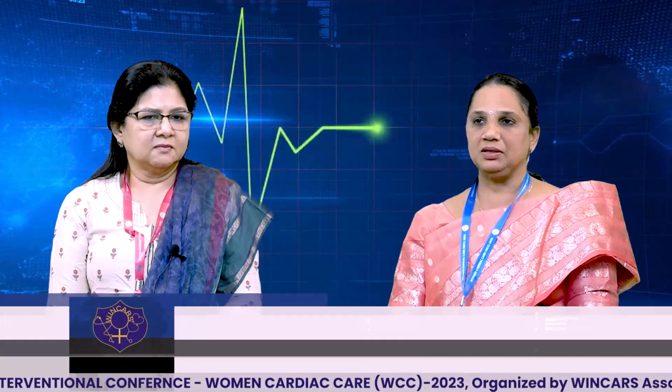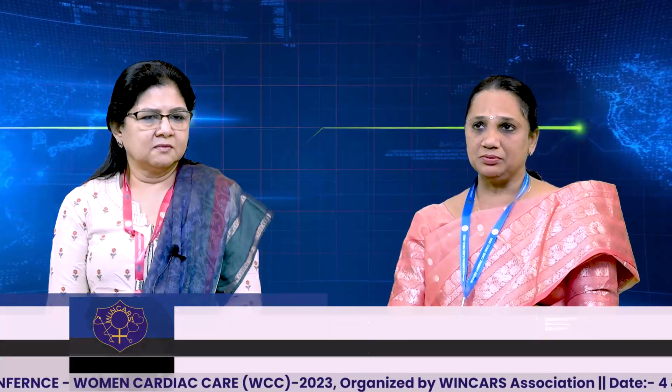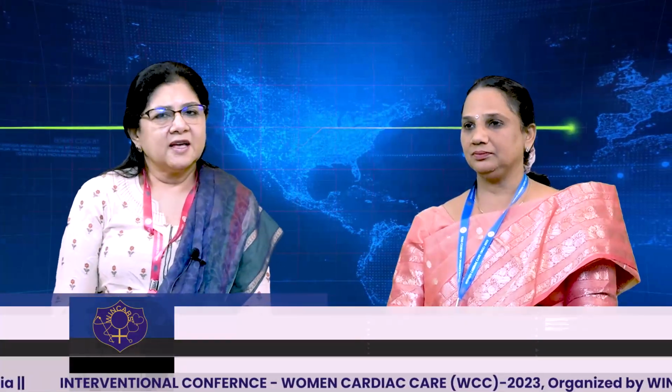You can use an IVL balloon safely, and the learning curve is extremely low because all interventional cardiologists know how to use a balloon, and this is similar to that, a little more bulky. But if you can deliver it with the help of a guide extension catheter, even this can be tackled in most scenarios. Excellent input, ma'am.